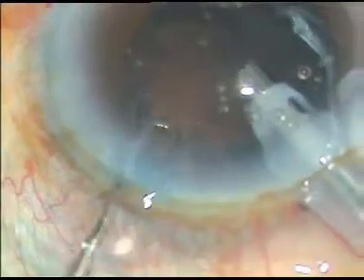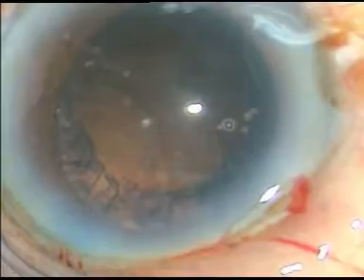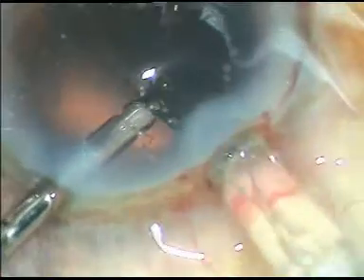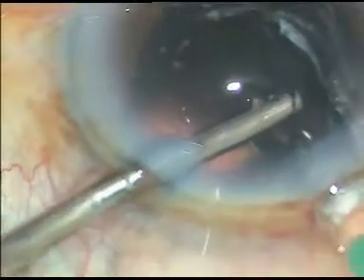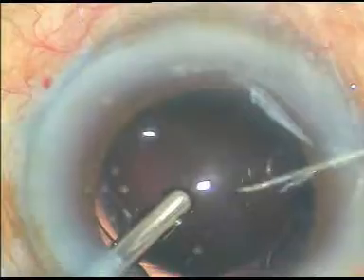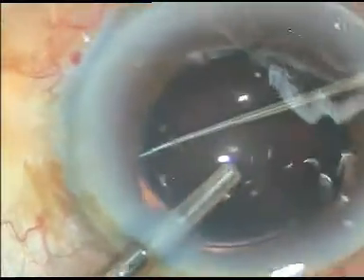Once the epinucleus is removed, a viscoelastic substance is used to maintain the anterior chamber, and the cortical matter is removed. An IOL is then implanted in the capsular bag — the leading haptic goes into the capsular bag, and the trailing haptic is then placed into the capsular bag.